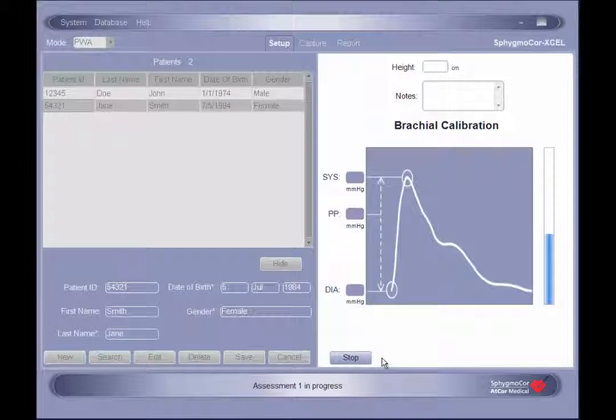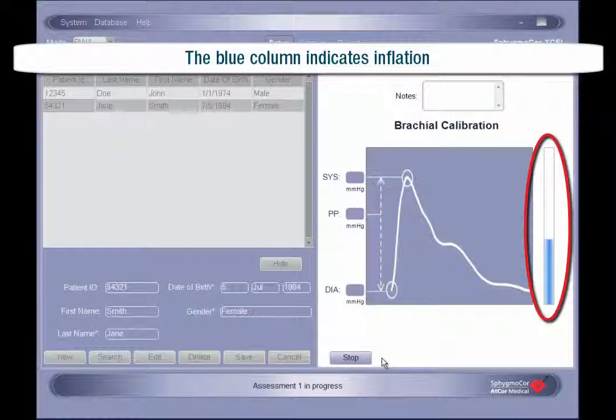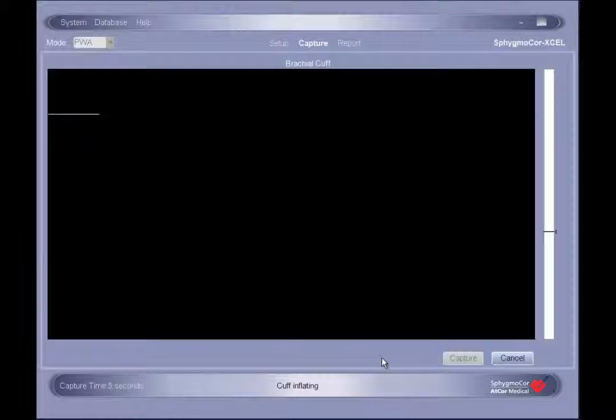The SphygmoCor XCEL will automatically measure the patient's brachial systolic, diastolic, and pulse pressures. During cuff inflation and deflation, a blue column will appear to the right of the waveform graphic to provide a visual indication of the change in cuff pressure. Once the brachial pressure measurement is complete, there will be a 5-second delay before the cuff automatically begins inflating for pulse wave analysis capture. Initially, during cuff inflation, there will be no immediate response on the screen.